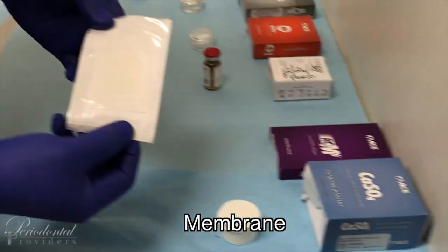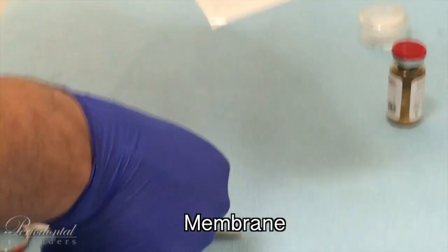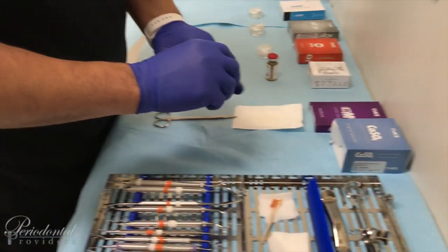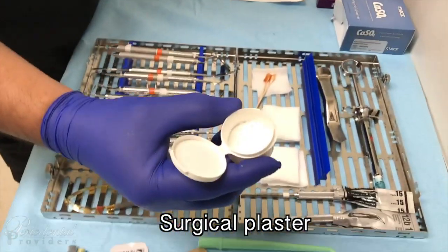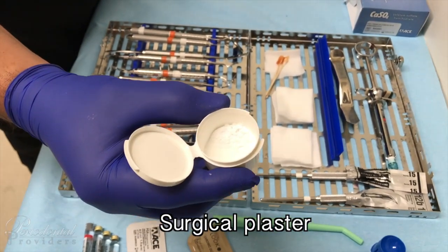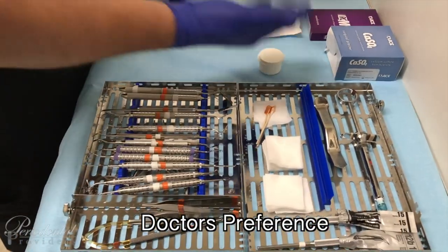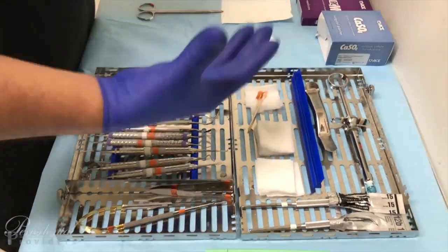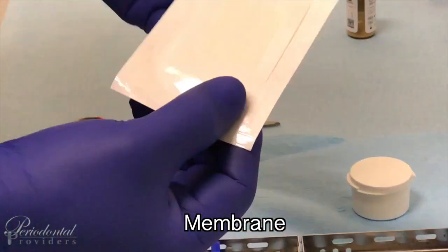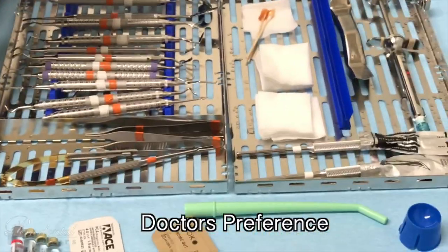Here we have a resorbable membrane that comes in a paper format. We will need to utilize sterile scissors prior to the procedure to cut it to size. Then we move on to our surgery plaster, which can be used either as an individual placement over the bone grafting material or mixed in with it — both ways work. This hardens with the bone grafting material so it doesn't disperse, versus being tented with the membrane. This is utilized while doing extractions and socket preservations — doctor preference.